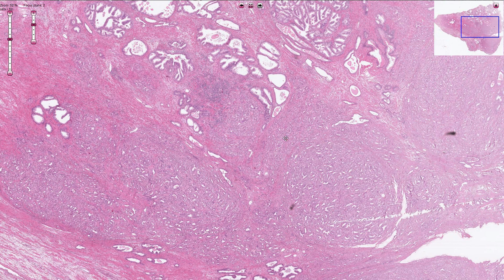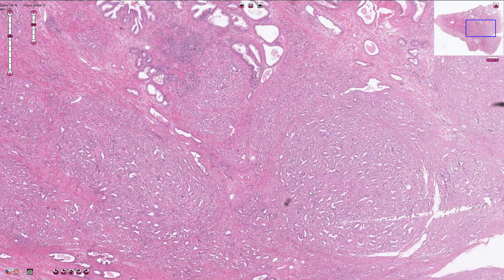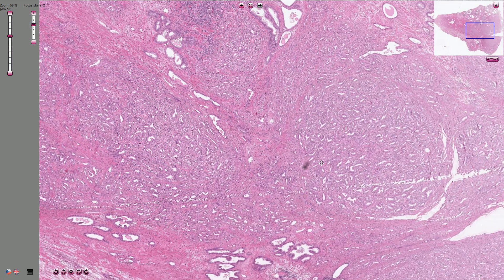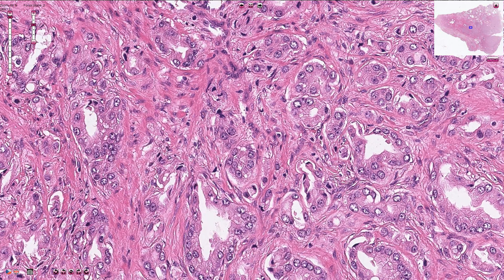The malignant component here is composed of densely packed, back-to-back small glands or acini. On higher magnification we can see that these small acini are composed of just one layer of acinar cells, without the layer of basal cells, unlike normal benign prostatic acini. The acini are very close to one another — this is also called back-to-back glands.